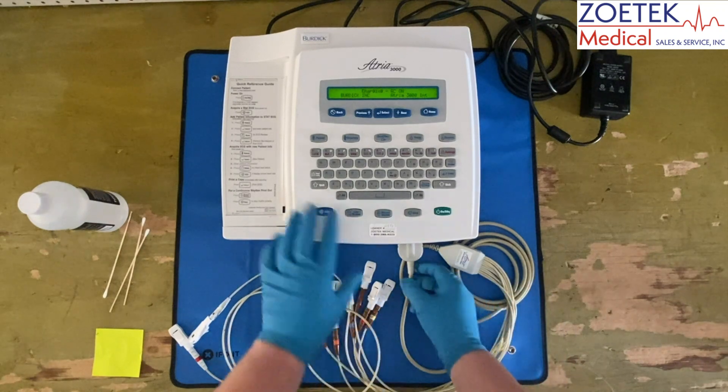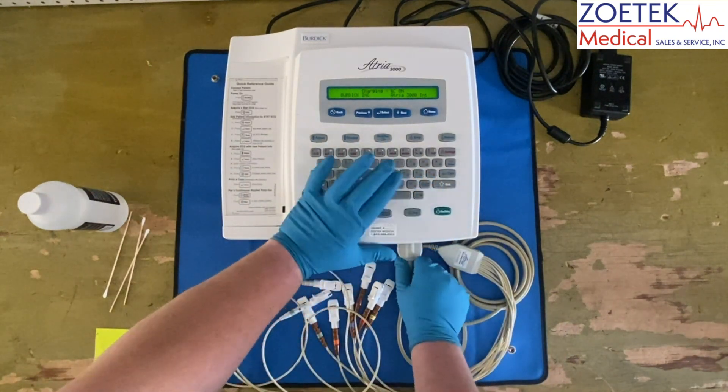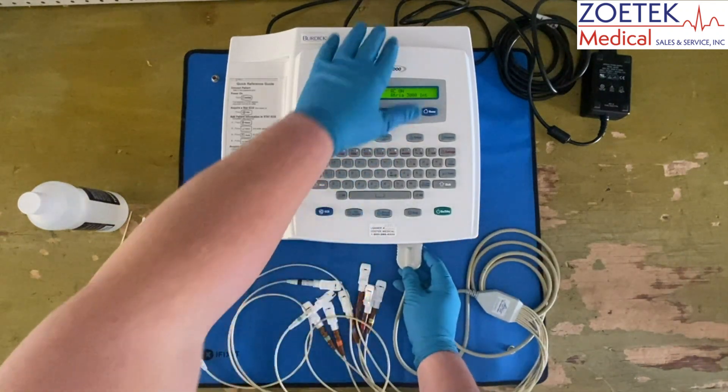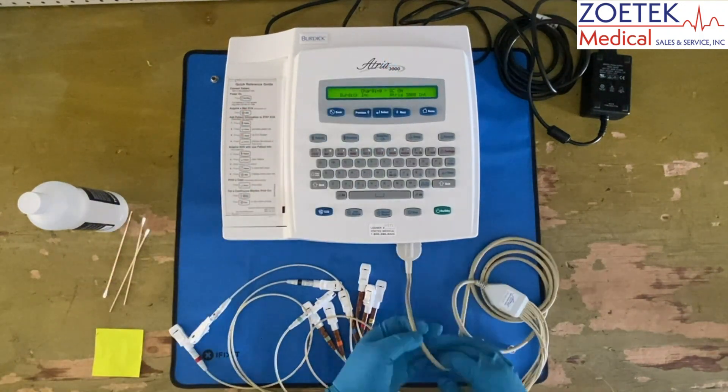If noise and artifacts persist, inspect the lead cable connection to the EKG. It is typically best to remove the connection and check the connector itself for damage. After reinstalling the cable, verify there is no physical damage to the wire sheathing of the lead cables.